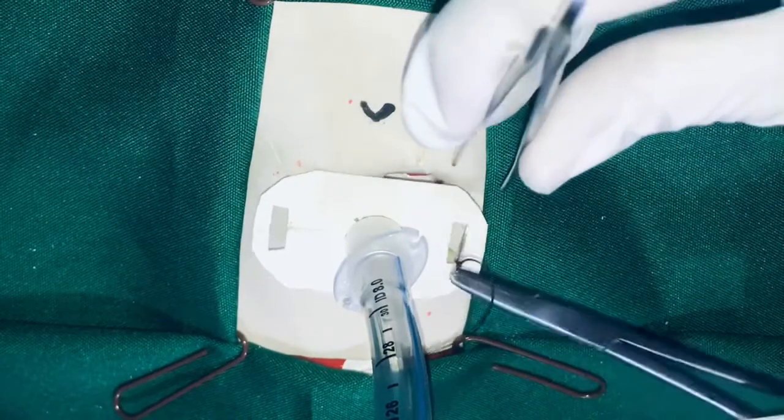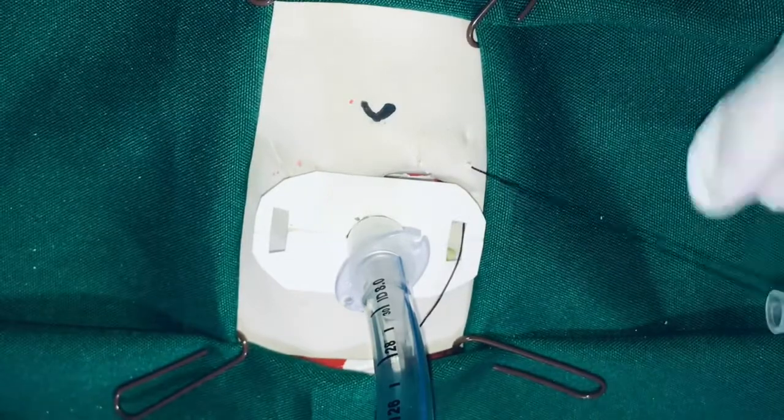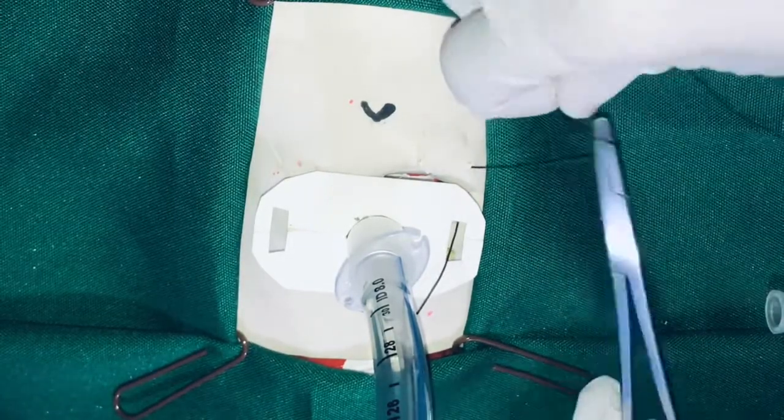Secure the tube with sutures but not too tightly because it can cause surgical emphysema.